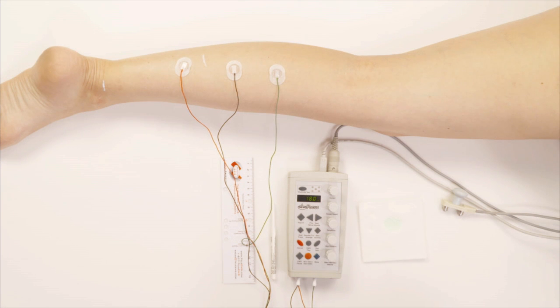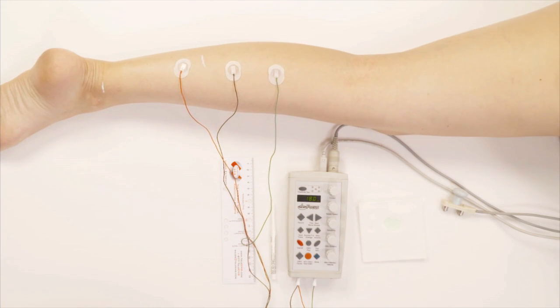Now normally we do the H reflex on both sides because we want to compare latency and amplitude in both areas. And the H reflex is very useful for patients who have low back pain. And those patients, usually the H reflex will either be very slow or completely disappears.